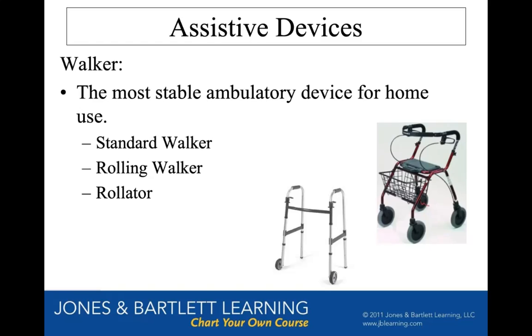The rollators really allow people to have a lot more independence in the community, and they're really good. But don't think that a rollator is better than a rolling walker, because just a regular rolling walker with 2 wheels is much sturdier and safer than a rollator.